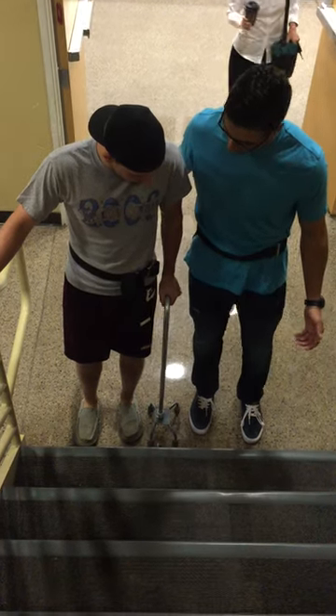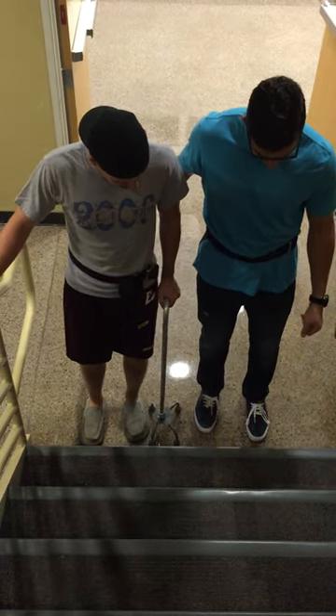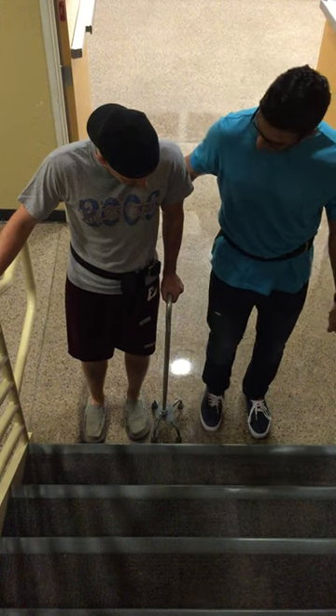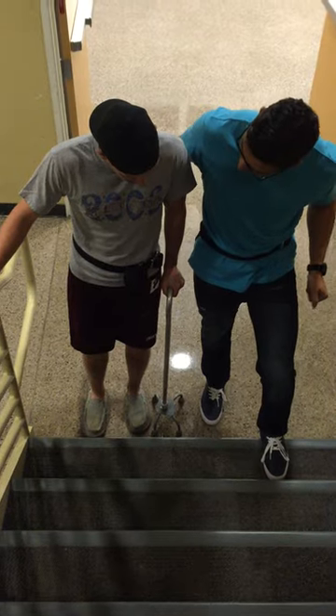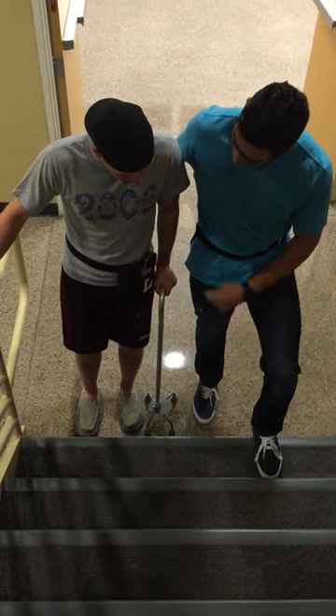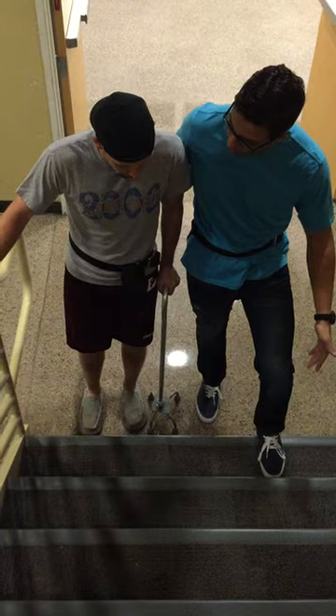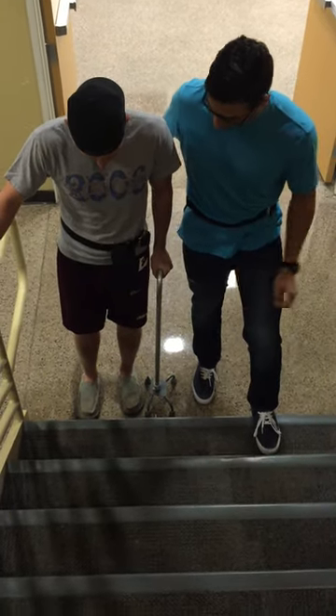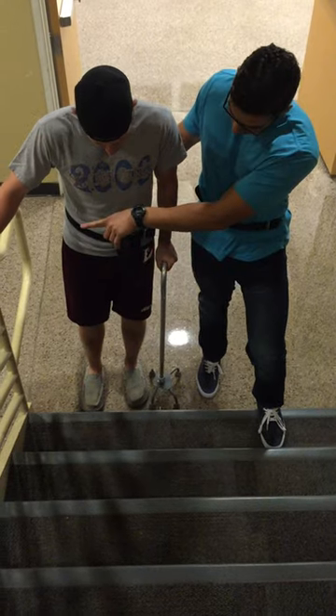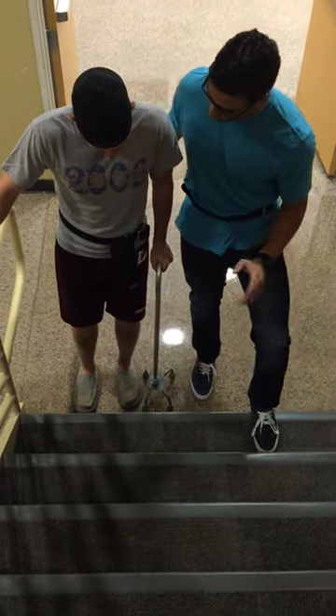As far as sequencing goes, what I want you to do here first is step up with your left one, then leave the cane behind so you can push up through it, and then we're going to bring your right leg up. So it's going to go left leg, right leg. And I'm going to be right here — use the handrail if you need it — I'm going to be right behind your hip to give some support.